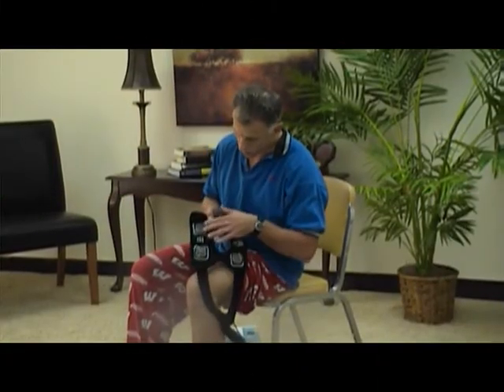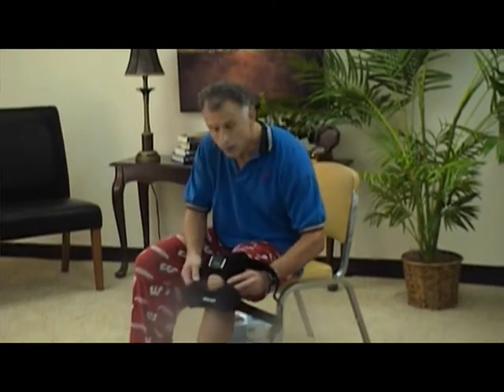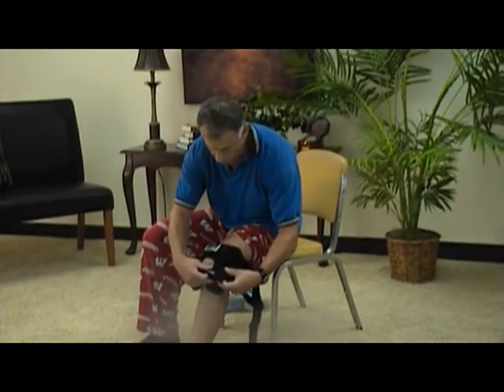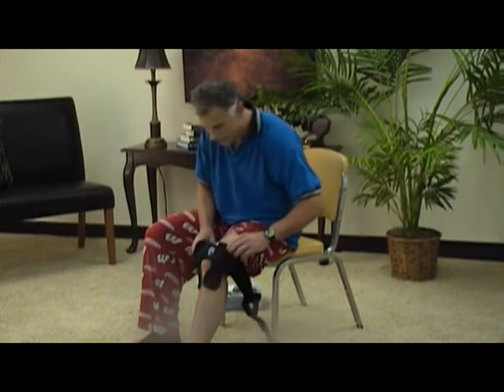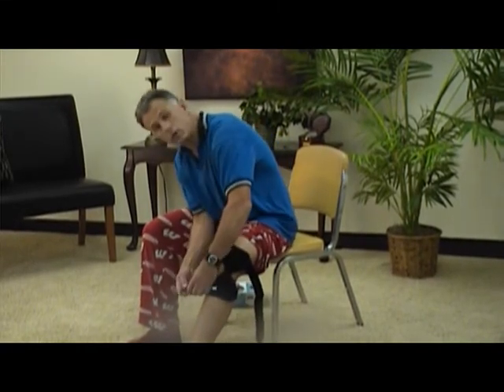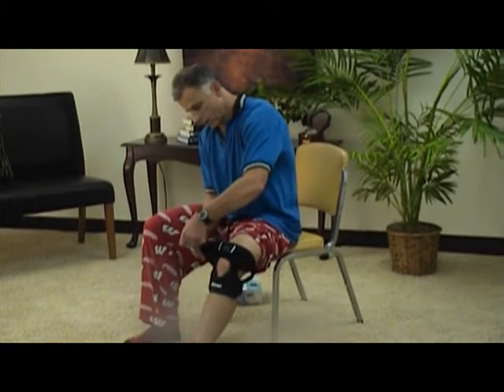Now I've put all of the electrode contact pads on there, and there's a hole here that goes over the kneecap. Make sure you put it on so you can read the MP upright, just like so. Be a little careful and make sure the knee is about halfway bent when you put this on, and you put a pad there and there. These pads are actually loose so that when you flex and range your knee, it doesn't pull and they won't come off. So you put those pads here and here, and these will just fall right into place on top. And there are simple, old Velcro straps, which work wonderfully and have changed life in our society since Velcro became so popular in the last 30, 40 years. And Velcro it on like so.